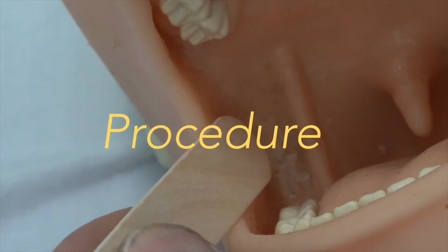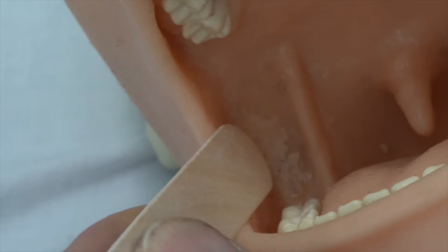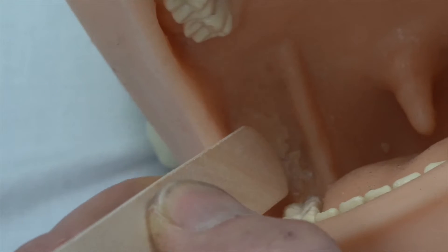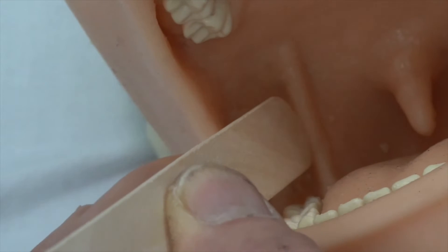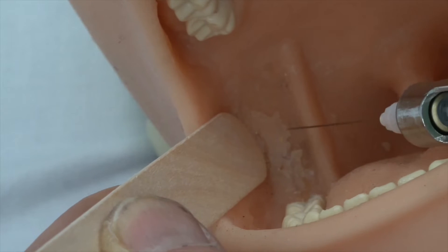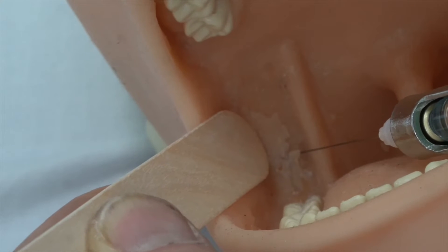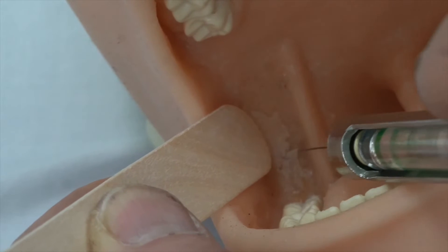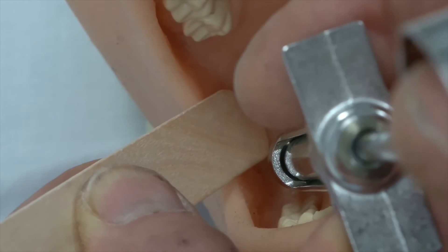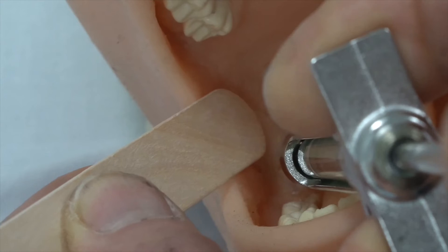A dry socket on a lower molar can be managed with a mix of an inferior alveolar nerve block and a buccal sulcus block. To place an inferior alveolar block, identify the fold of skin — then advance the needle from the opposite pre-molar, going just lateral to that fold of skin, about five or ten millimetres above the level of the teeth. Slide the needle between that fold of skin and the mandible, advancing it about two-thirds of the length of the needle and injecting three or four mils of local anaesthetic.